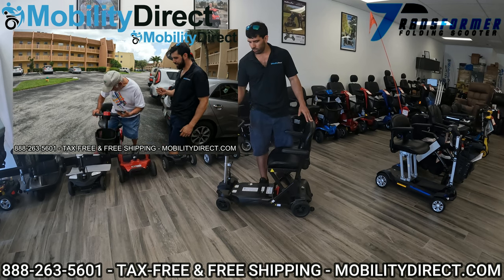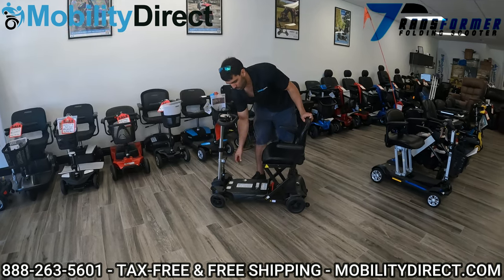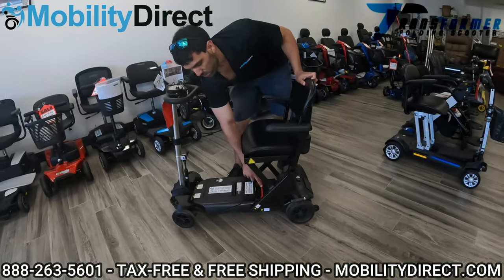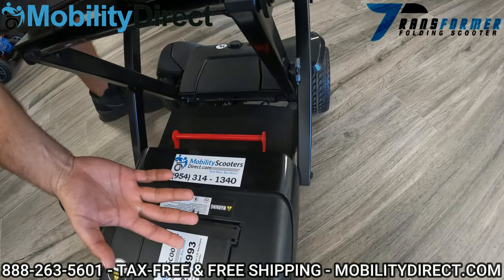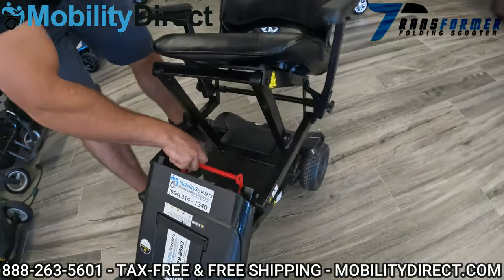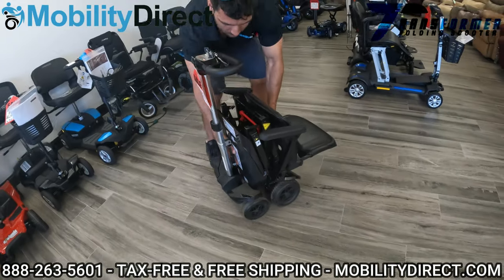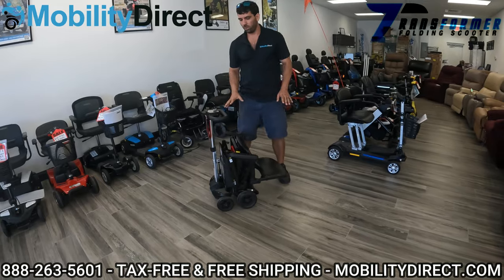Now on this Transformer scooter, there is a red lever, which you can see right here, which is used to manually fold and unfold your scooter in the event that you run out of battery. I'm going to demonstrate that — I'm going to use this lever and fold it manually. So now the scooter has been manually folded.